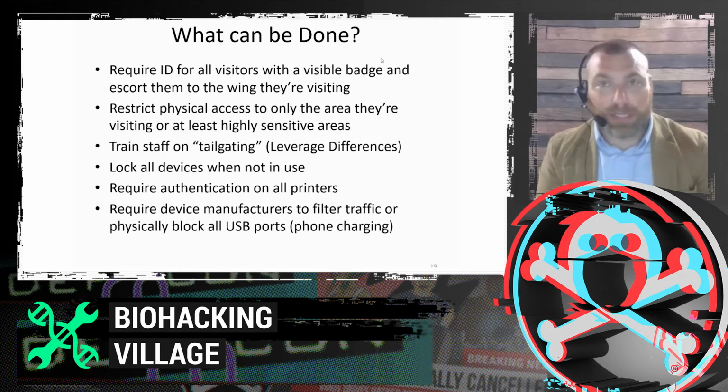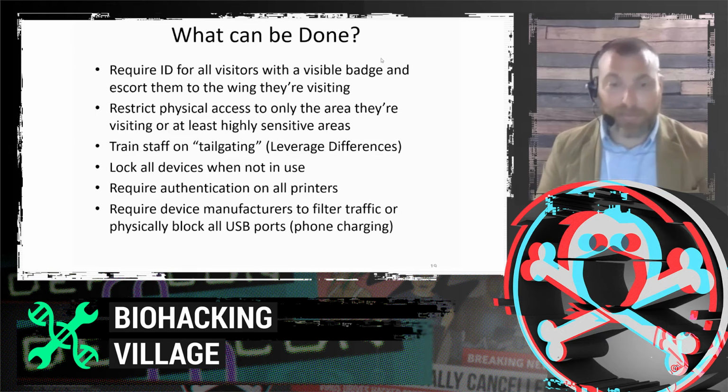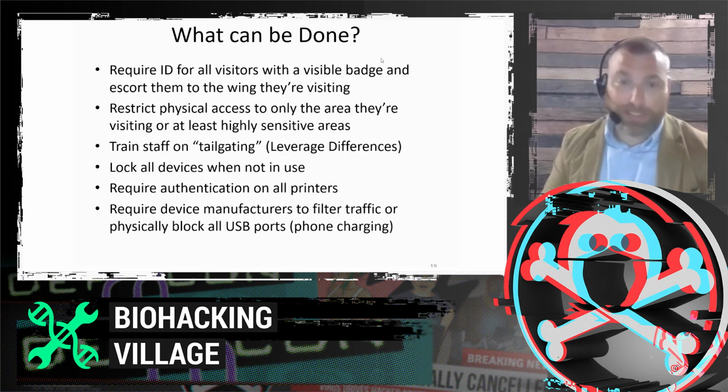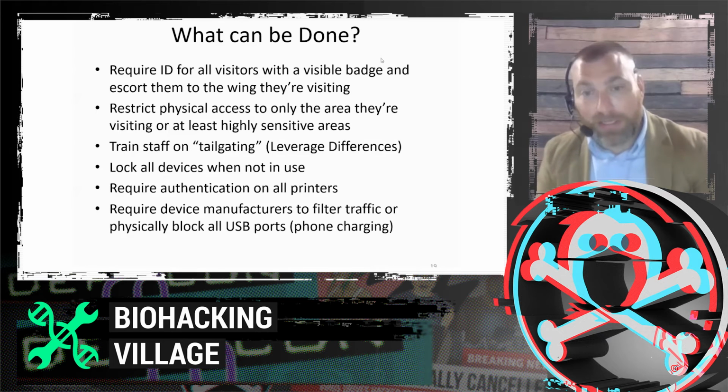You're probably looking at hospitals that do it well doing a tap-and-go system. So I have my card on a lanyard and I'm just tapping it on each device that I have access to. And that's going to look different across your hospital. Certainly in the ER, there's a little bit more risk because you have people coming into the ER constantly, and certainly guests of people that are there.